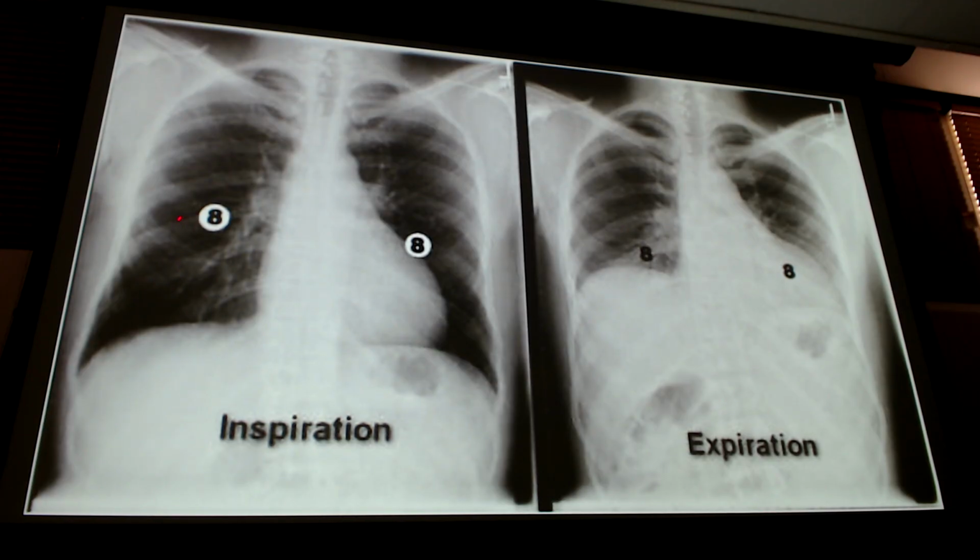But look at my inspiratory. So this is where rib number 8 is on both sides. We haven't started counting them yet. We will, coming up. But I'm just showing you where the diaphragm is below rib 8 posteriorly. As far as inspiration goes, we're good to go. Once I get to number 8, it's the whole rib, guys and gals, the whole rib. Not just here. Trace it all the way down to the edge of the thorax and make sure the diaphragm is below the entire rib.